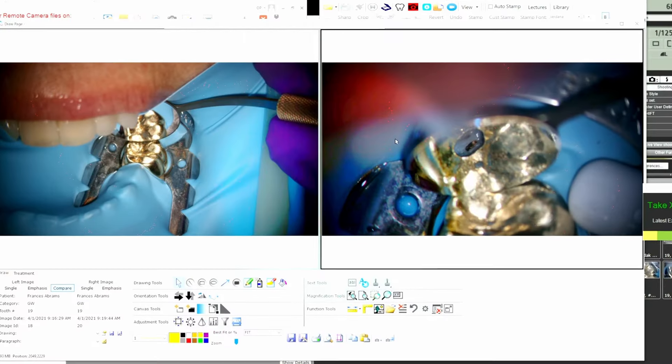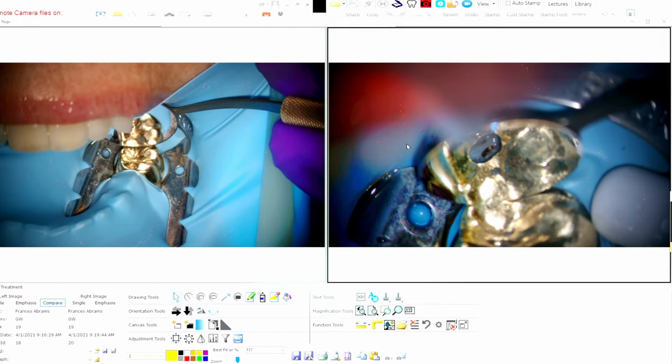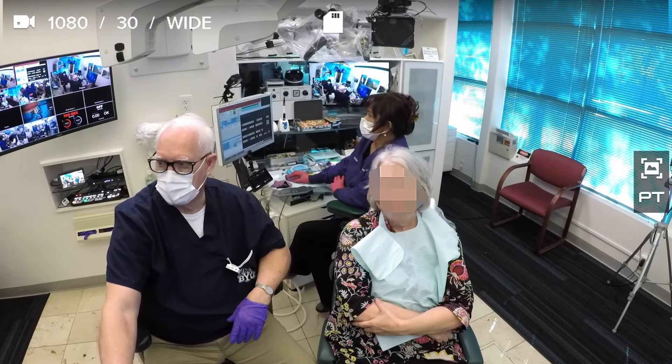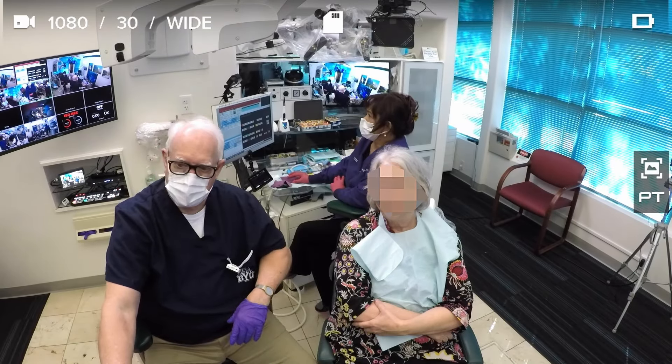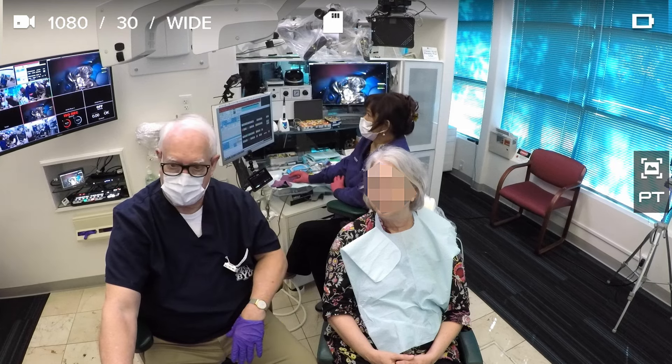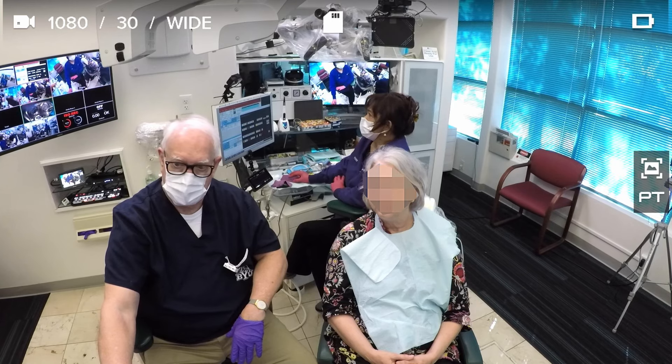This material here was a buildup material that they cut over the root canal when it was done. So this is where it gets kind of dicey, because I need to remove this, but I don't want to go too deep. And that pink material — that's the gutta percha. That's the older root canal material.